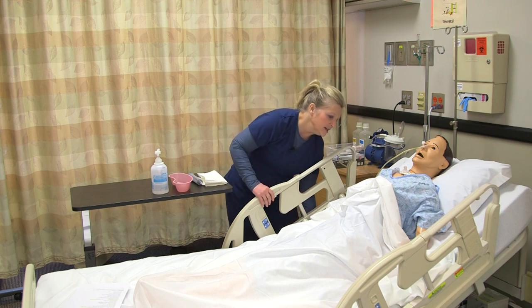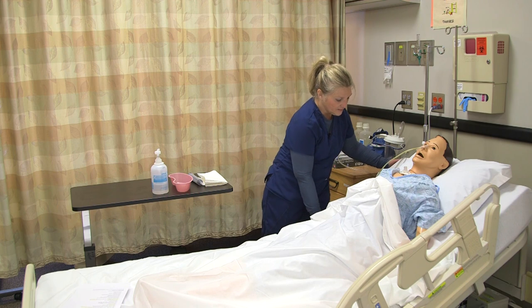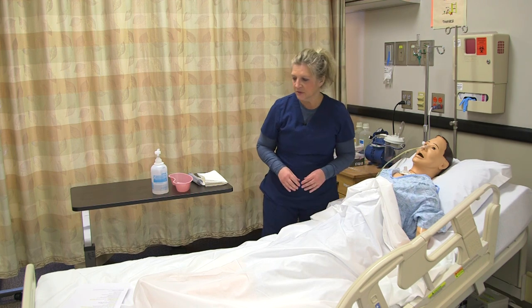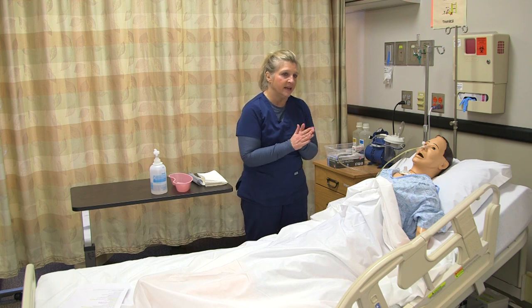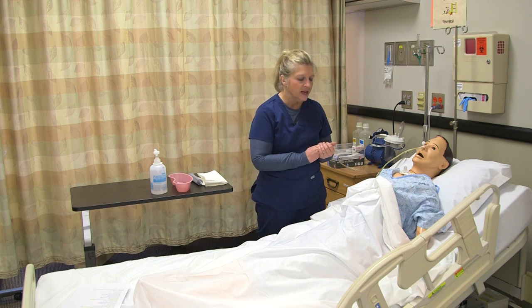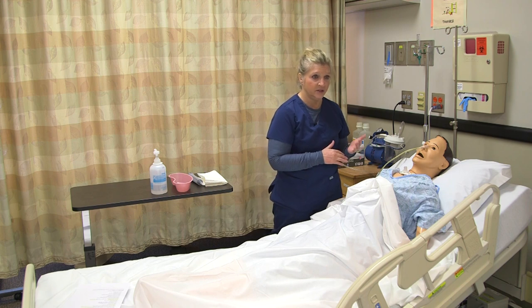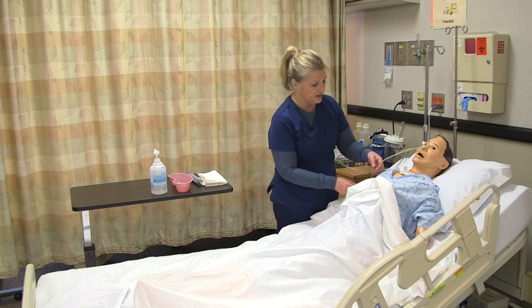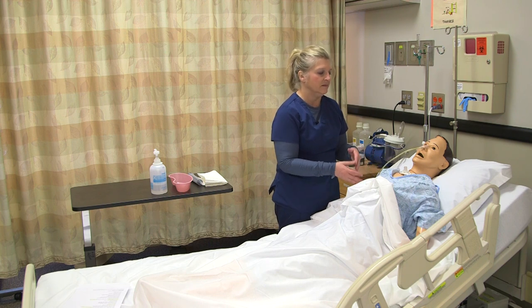I explained that to my patient and then I'm going to do my GI assessment prior to removal. I'm also going to make sure that I verify the external length to make sure that between the time it was last verified and now, the tube has not migrated. You verify that with the length that was initially used after the chest x-ray to confirm placement. The length is the same.